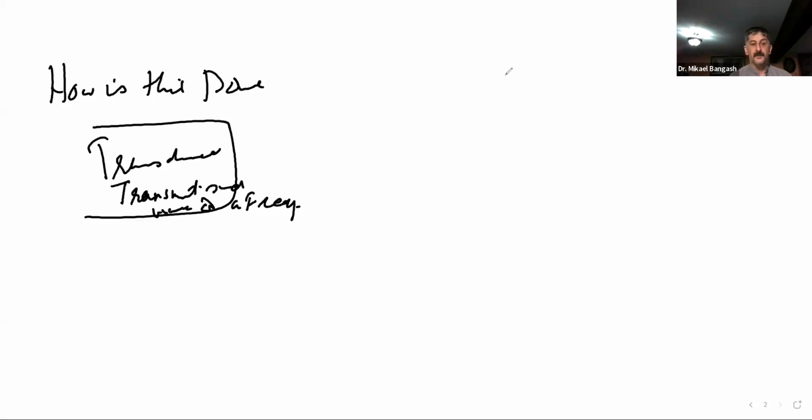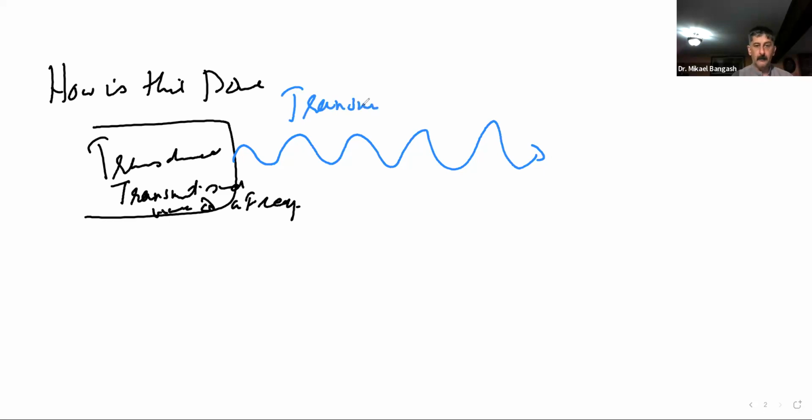In chapter 17, we called this frequency the fundamental frequency. In all the previous chapters, we just called it the frequency of the transducer. We're just going to say that whatever frequency the sound wave is being transmitted at is going to be referred to as the transmitted frequency.